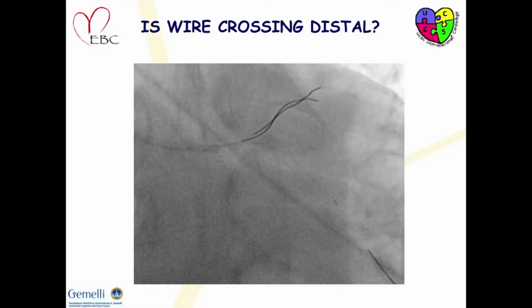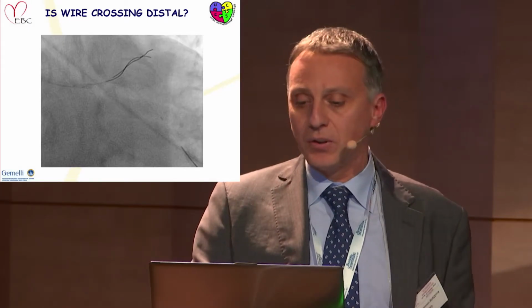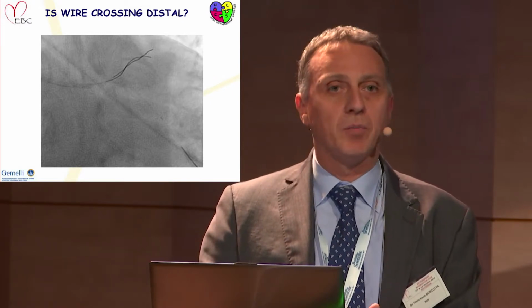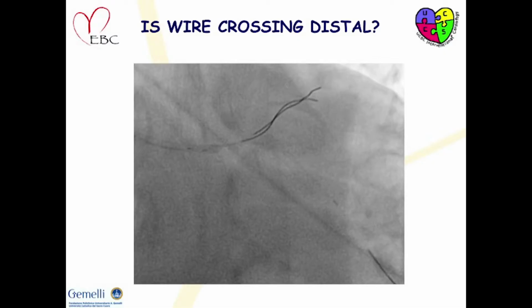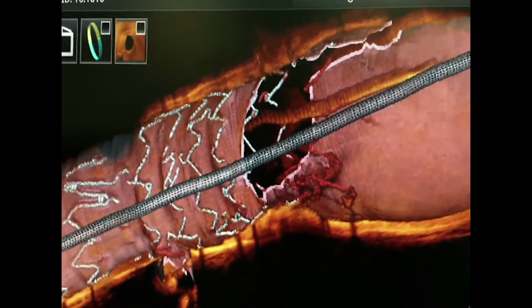In the same procedure, we decided to correct this in the only way I had in mind, so to perform culotte. But you don't want to have, at the end, other floating struts. So distal rewiring is performed, and is checked by angio with the two wires, the jailed wire and the rewiring wire at the carina.